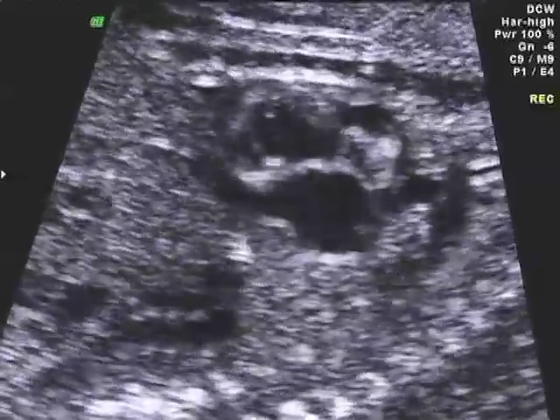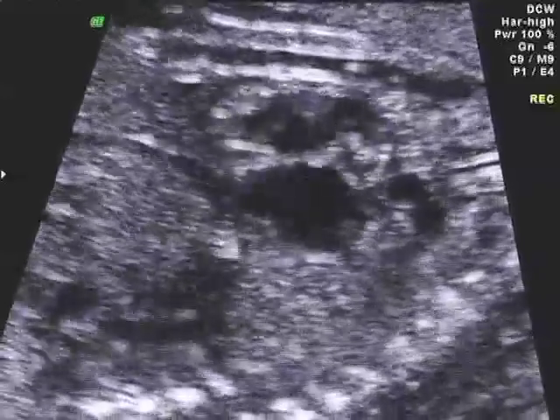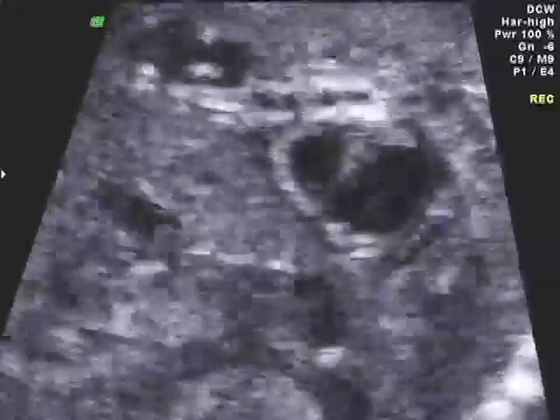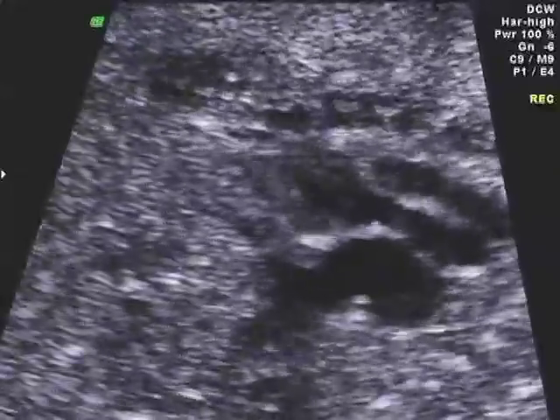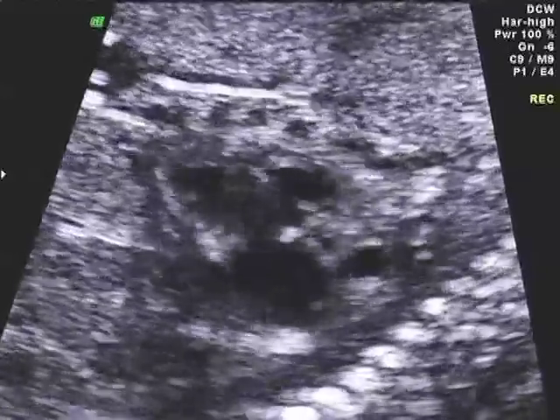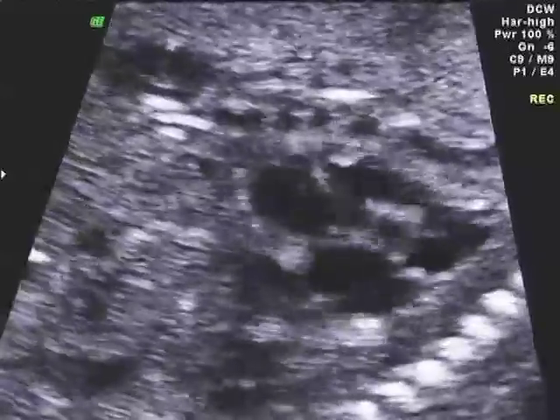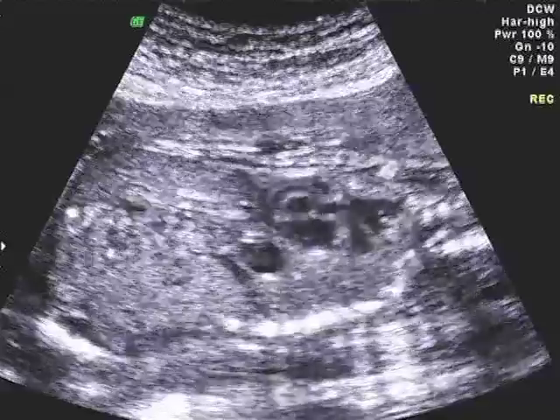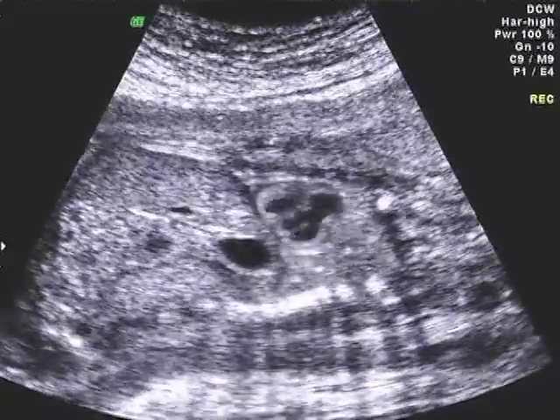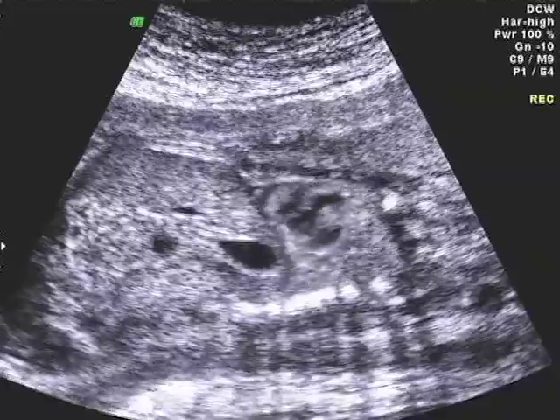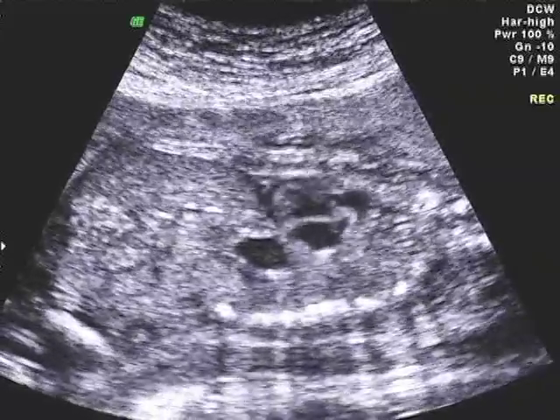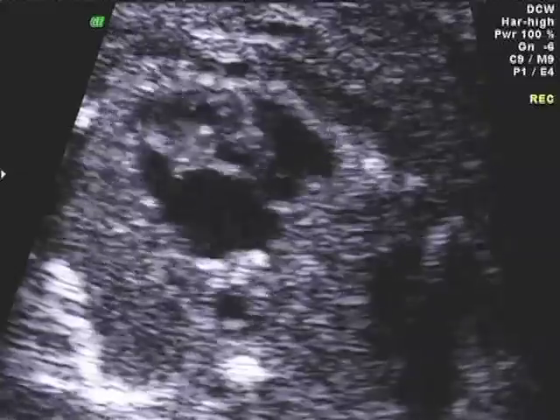We have to look for ventricular septal defects and also pulmonic stenosis. These babies can also have different forms of heart block because of the atrioventricular discordance.